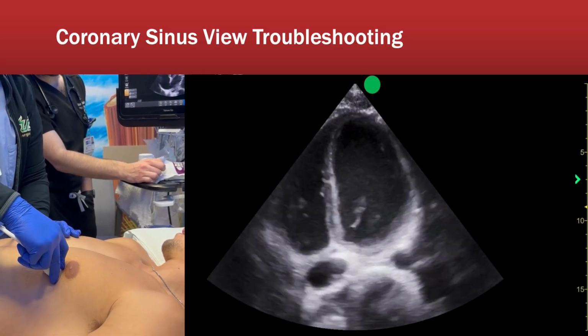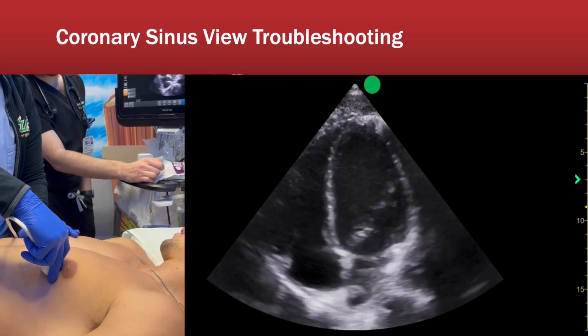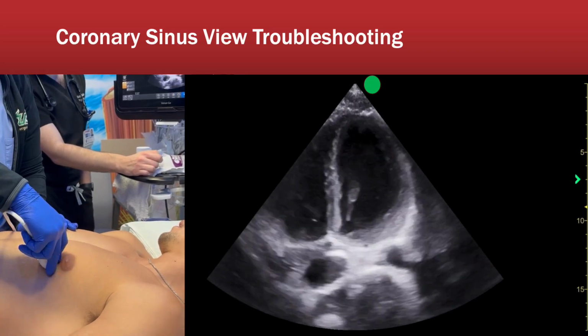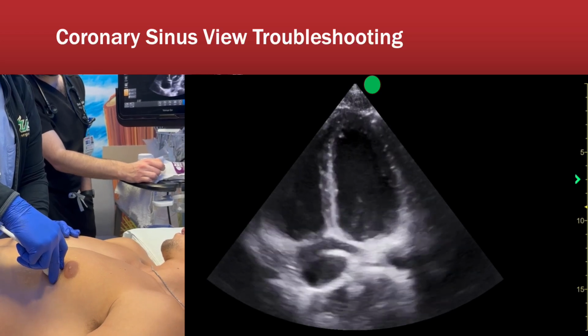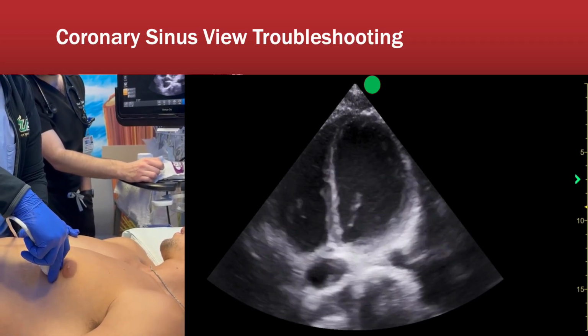Again, you can see it's a very slight motion that I'm doing over here. I go from being a little bit more perpendicular to the skin to just dropping my hand ever so slightly. And that will go from having this coronary sinus to opening the atriums like you see here.